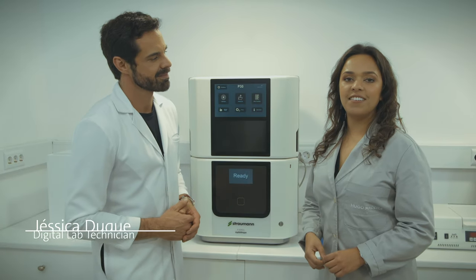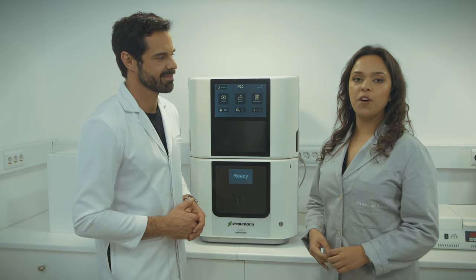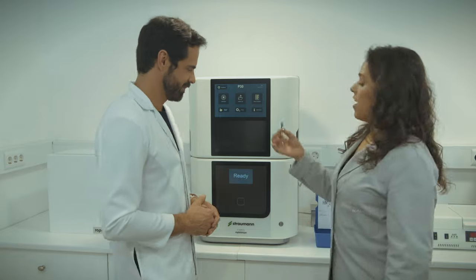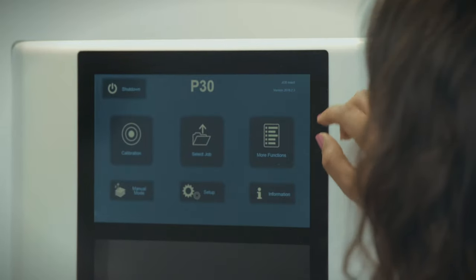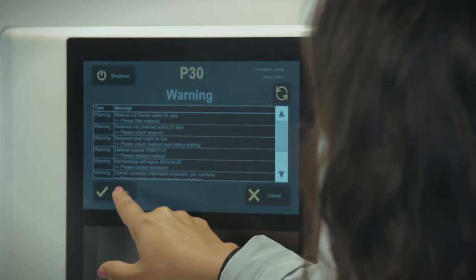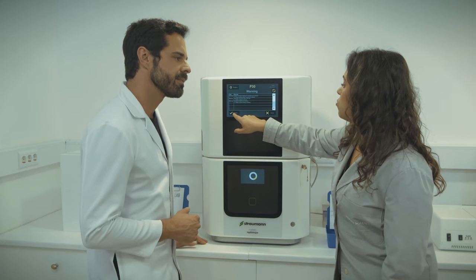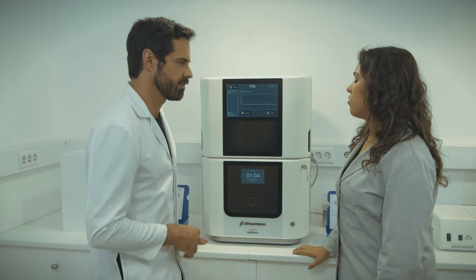Hi, my name is Jessica Duke. I'm a digital dental technician and now I will show you how you print a model in a 3D printer. Now I have the file in my pen drive. I put it here and select a job. Put start and now confirm everything. The material you choose at that point? No, the material I will choose in NetFab, in the software, before.